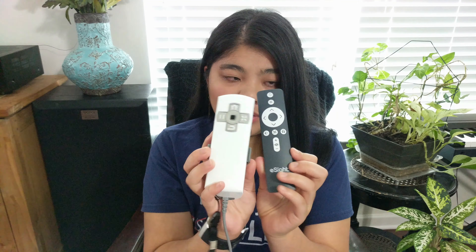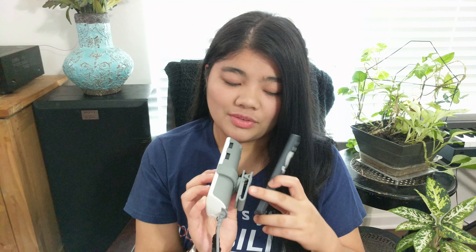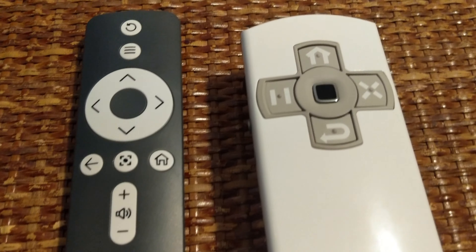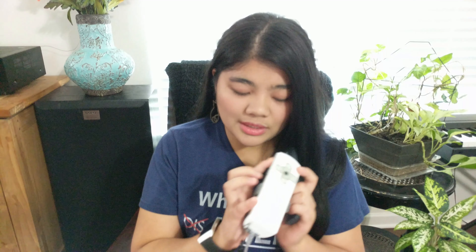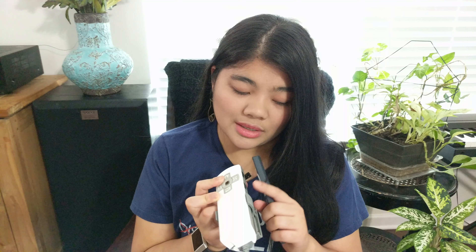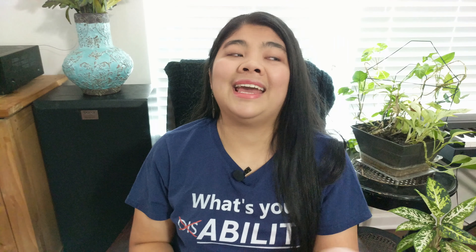Here are the two remotes side by side. The eSight 3's remote is definitely thicker and much wider. The eSight 4 remote is definitely a lot easier to use. The eSight 3 has dials on the side with different functionalities when pushed, plus five buttons on the front. Coming from the perspective of somebody who uses a lot of assistive technology, the eSight 4 is definitely a lot easier to use overall.